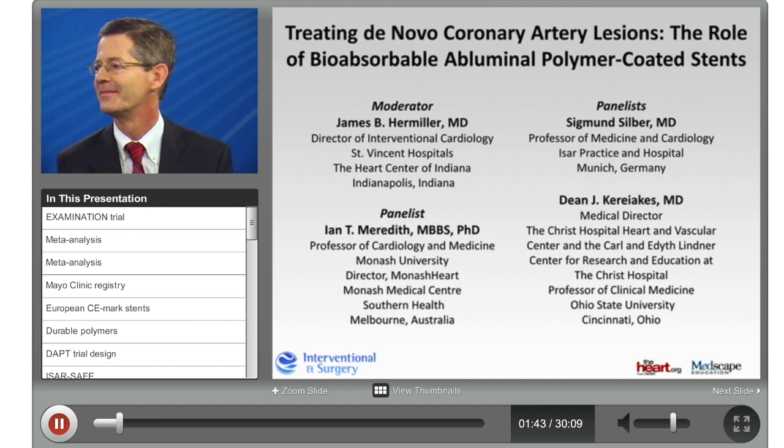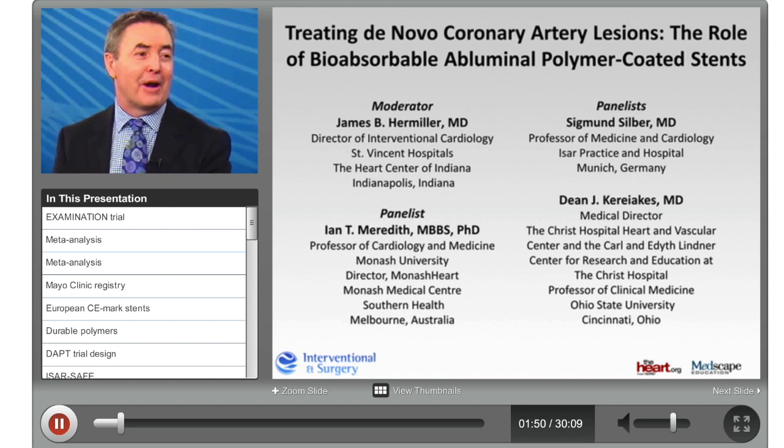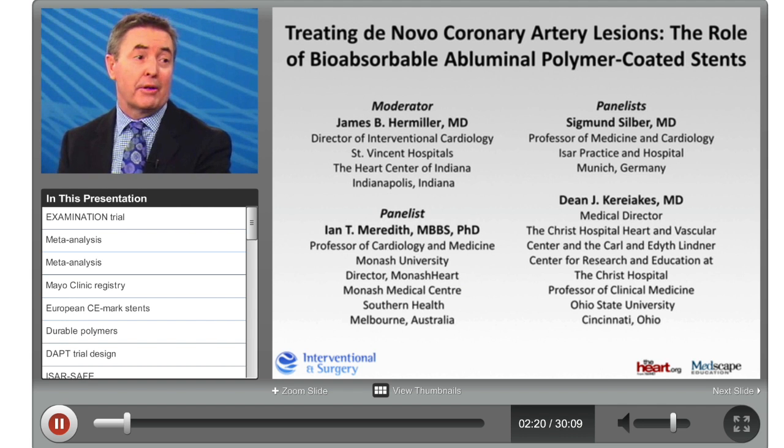Thanks. I think we'll probably all have comments to make here, but obviously we have recognised from histology studies and from clinical studies that conformable durable polymers probably do lead to a background residual risk of late stent thrombosis and very late stent thrombotic events, partly because of inflammation, maybe partly because of malapposition of stents, but the durable polymers do give you chronic ongoing inflammation that increases your risk of late events and neoatherosclerosis. So the desire to look for an alternative, either no polymer at all or minimal polymer load, seems a very reasonable next iteration for drug-eluting stents.